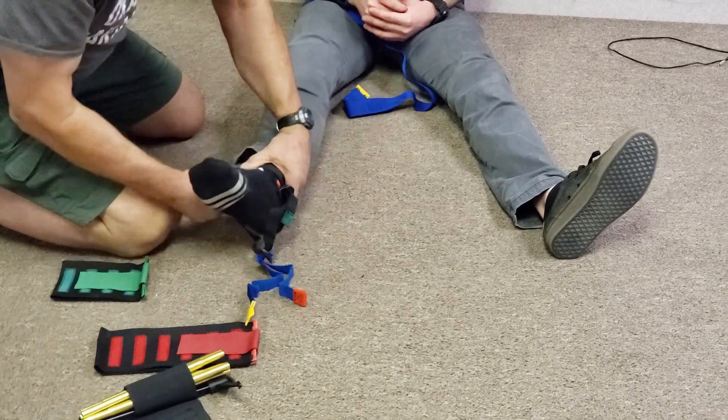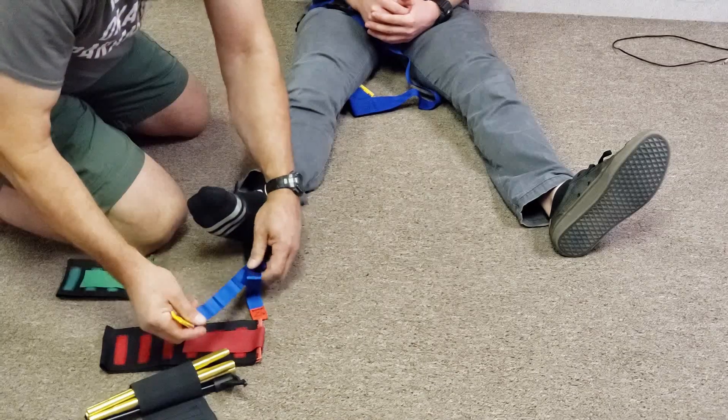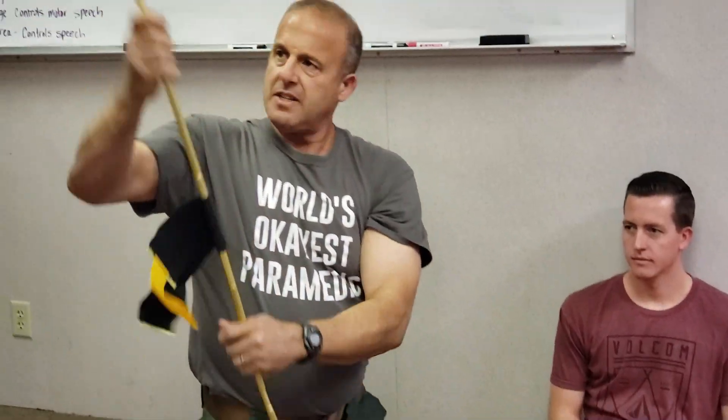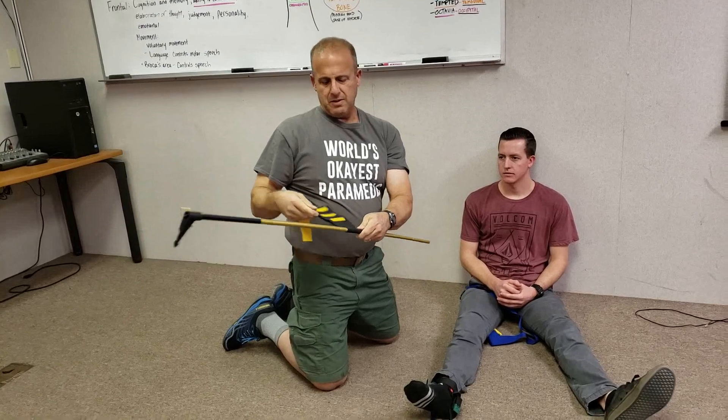While your assistant is holding traction, go ahead and apply the ankle piece. It has two tensioning systems — you need to play with this a little bit, but you can tension it from the green strap and from the blue strap.